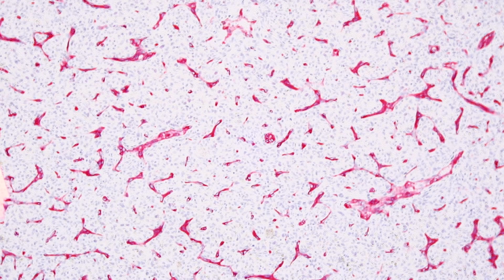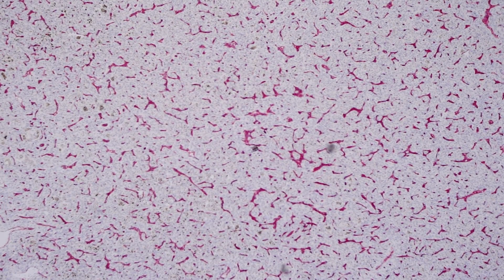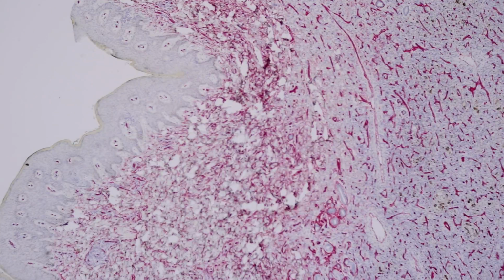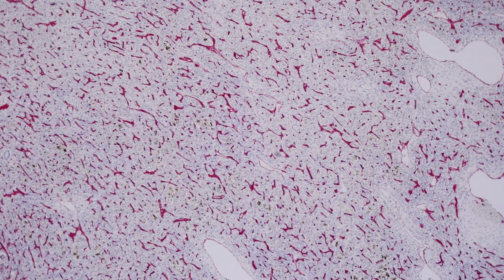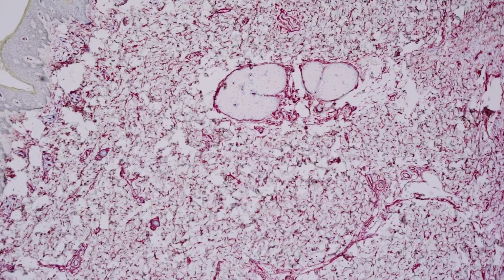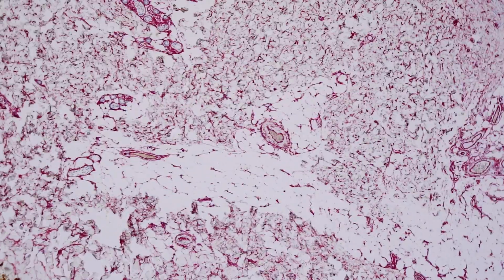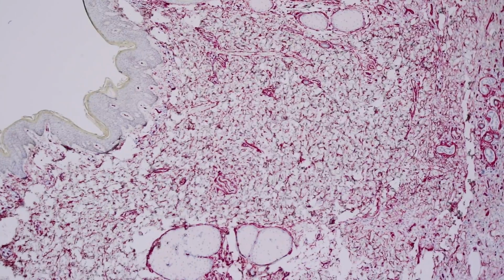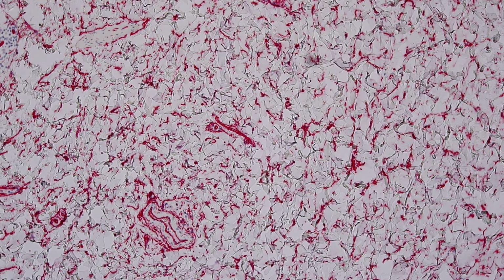Now, CD34, when it works like this, is great. But the problem is that in some dermatofibromas, it will stain, particularly at the edge of the tumor. And the reason is, let's look, that's the tumor over here. Let's look at the normal dermis. Whoa, it's all red. The normal dermis is usually relatively strongly positive for CD34. All these dendritic cells, some form of dendrocytes.